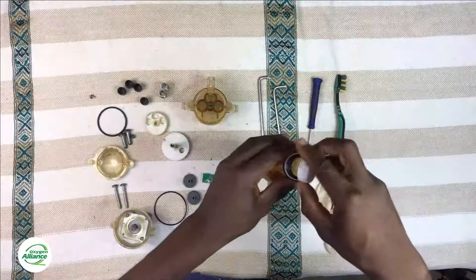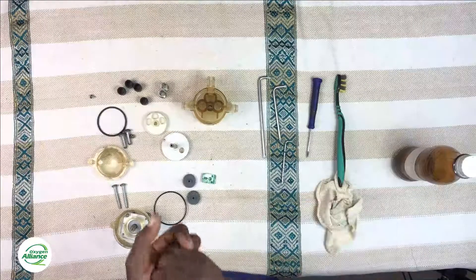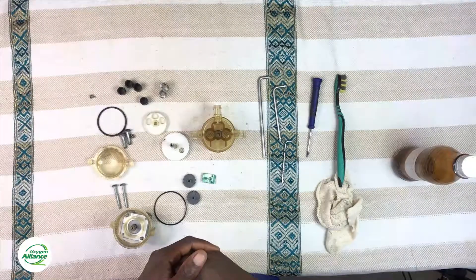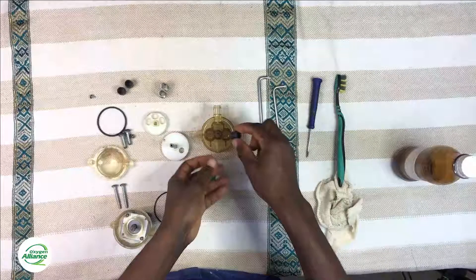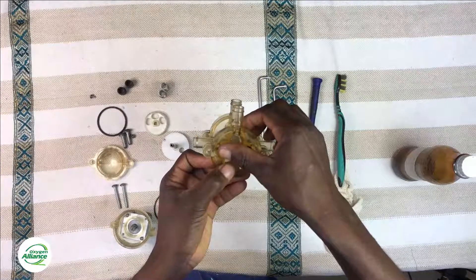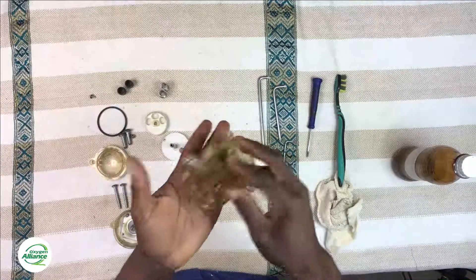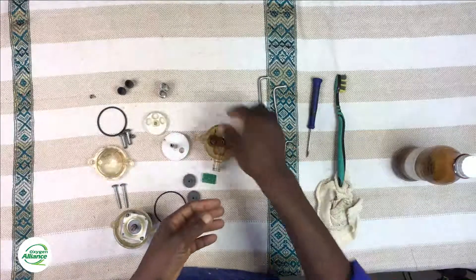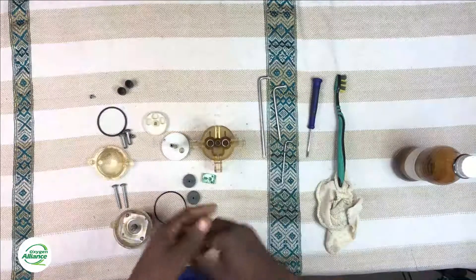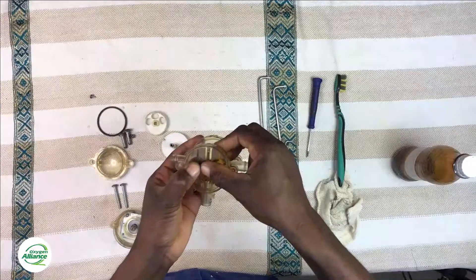Now let's get back to putting the rotary valve back together. The first thing to do is to put back the springs. Before putting back the springs, make sure the spring holders are inserted on one side of the rotary valve housing — just push them in slightly and they have a small rubber around them that holds them in place. Then flip it over, drop the springs inside the holes, and push in the remaining two spring holders to secure the springs in place.